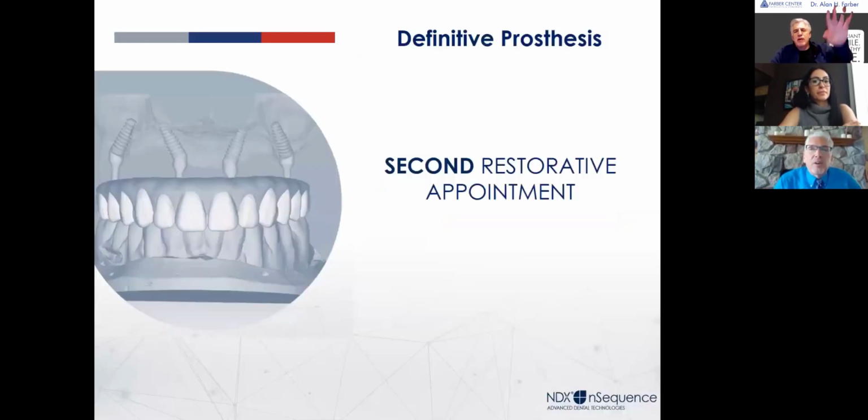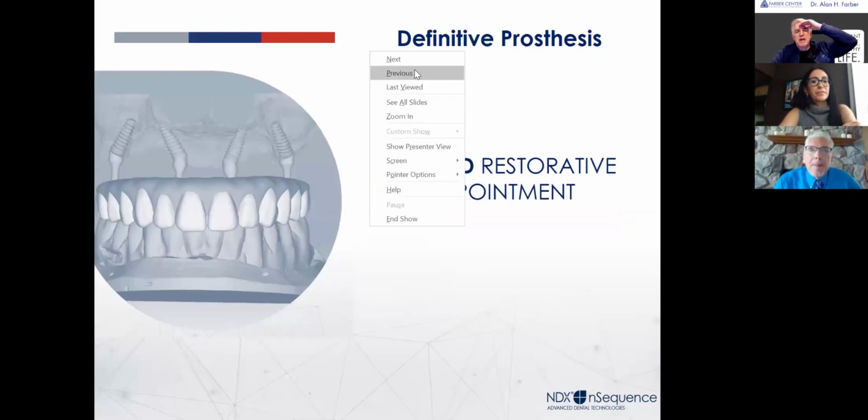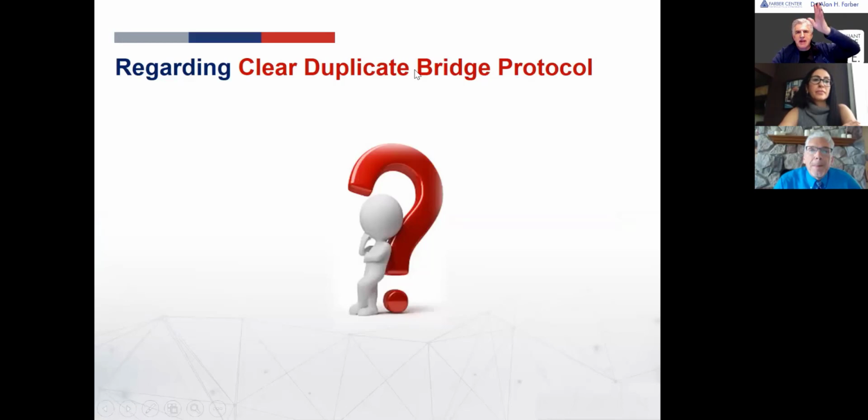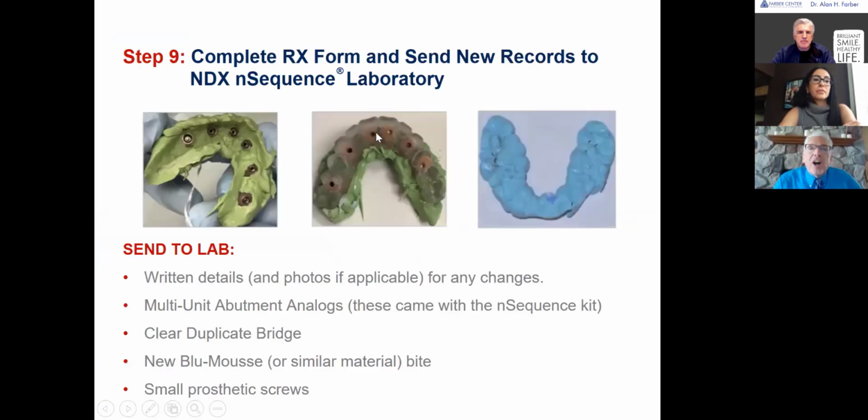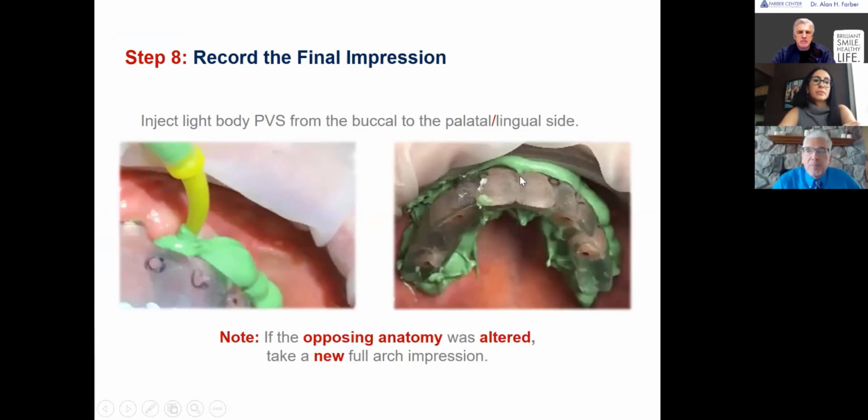Jeff, before you go on, one thing I've noticed, and maybe you could address, sometimes the midline is slightly off. So how do you want that indicated on the clear bridge? Mark it on the clear bridge. Either go ahead and literally mark it on the clear bridge, take a marker and put where you want it, or at least note it, because we have a midline here, we know where it is. If you don't like it, say move the midline to the mesial 1 millimeter, 2 millimeters, whatever it is. So either mark it, or for sure, I still mark it and also communicate it.